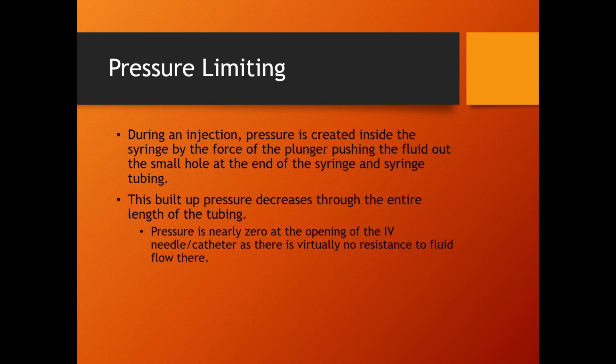All right. Questions? Yes. Is there a common pressure limit setting that they default to? Yes. Typically for CT and MRI, it's 300 or 325 PSI, and that's pretty standard.